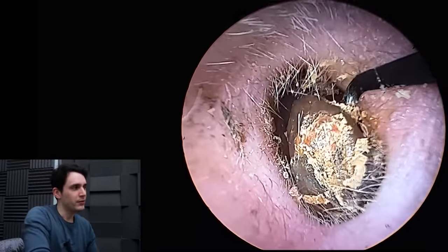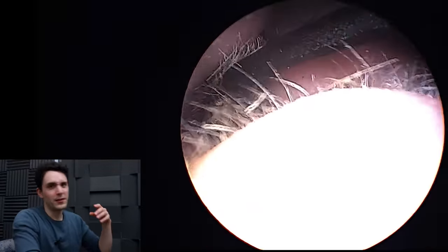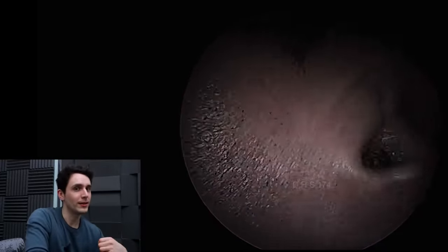This is the easy ear we're dealing with at the moment, and the patient's other ear is the difficult one — absolutely jam-packed with wax — so we're going to use all three tools to try and clear it.